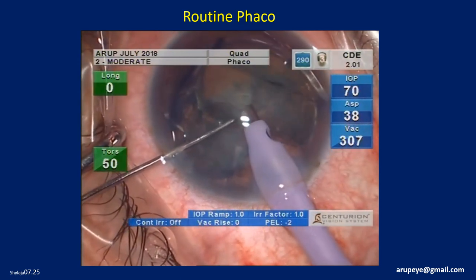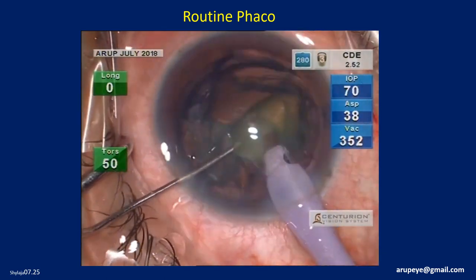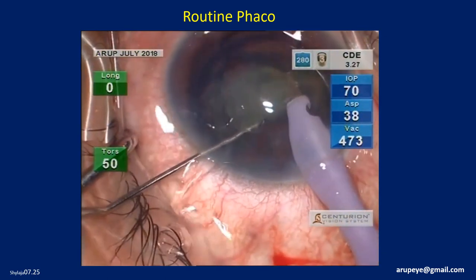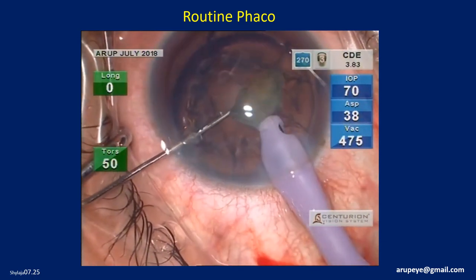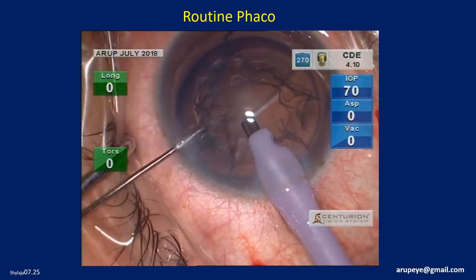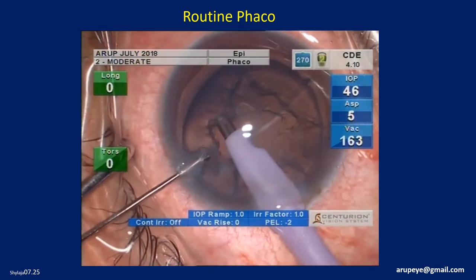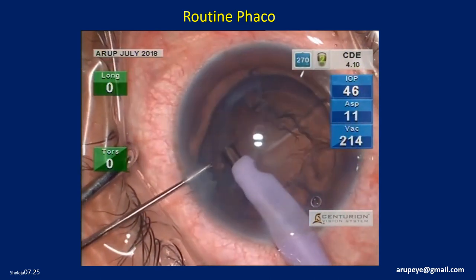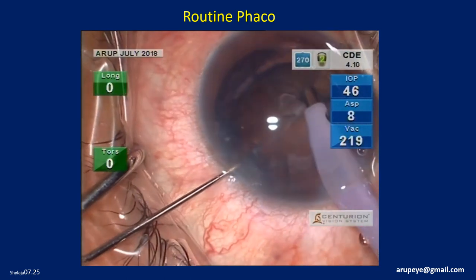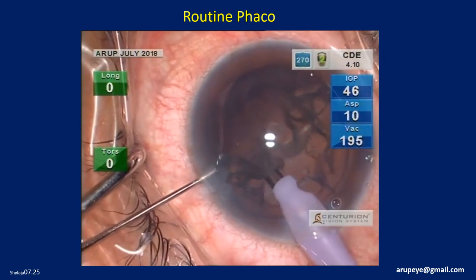The manipulations and fragment consumption are all confined to a posterior plane away from the corneal endothelium. There is a thick layer of epinucleus as a result of the unintended hydrodelineation. Most of the epinucleus is removed using the epinucleus settings on the machine panel.